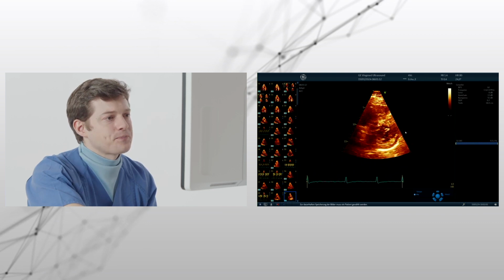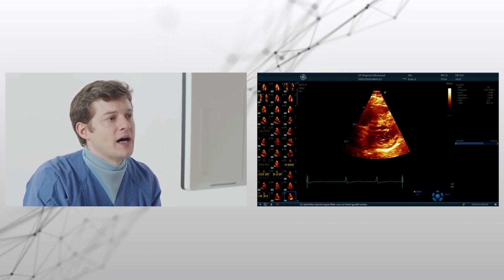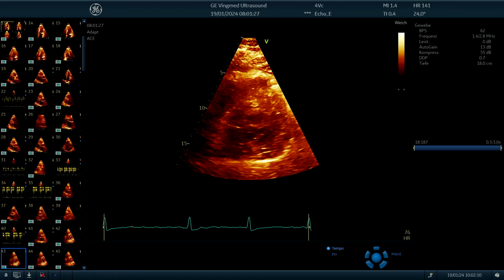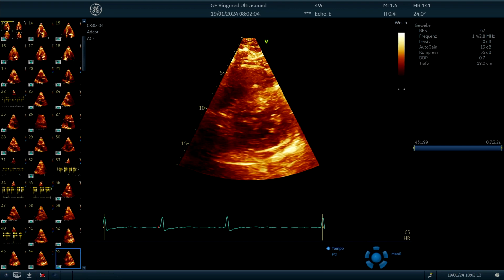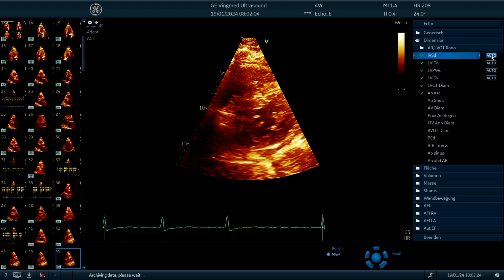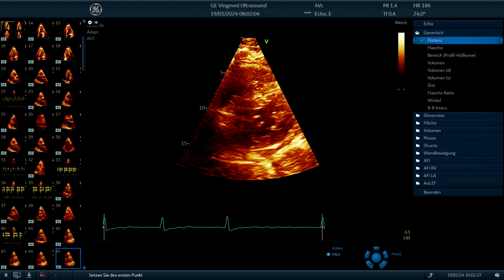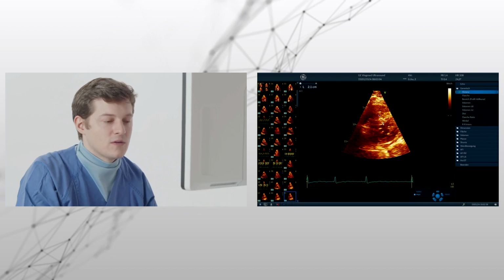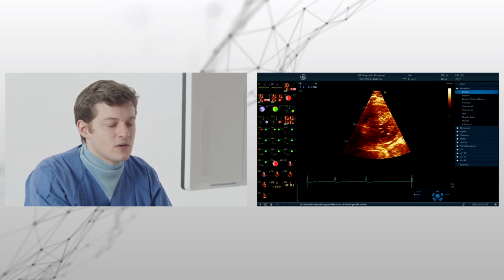Then we continue, and here we are in the short axis view, and we can try to measure the LV dimensions again, but here it's really hard to see, so we move on. Maybe we have a more optimal image. Let's try here at the papillary muscle level, but it's also very hard to see. So let me just see here, it's closed, and here's the maximally dilated ventricle, and let's just try with a normal distance measurement. Here is most likely the right ventricle. I would go until here. So again, we're in the similar range, but in this case, it's better to measure with contrast or, of course, an MRI, because the image quality is simply not optimal.